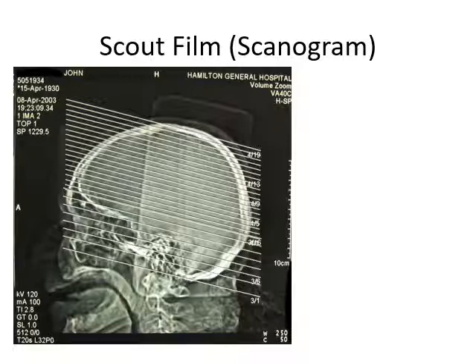So what we're going to see on the scanogram kind of tells the radiologist where all the pictures are coming from. It's coming from the top of his skull down through the base of the skull. And it's showing the radiologist it's cut in this diagonal direction. So it's not exactly straight. It's an axial cut, but it's being cut on a slant. So the radiologist can see all the slants.